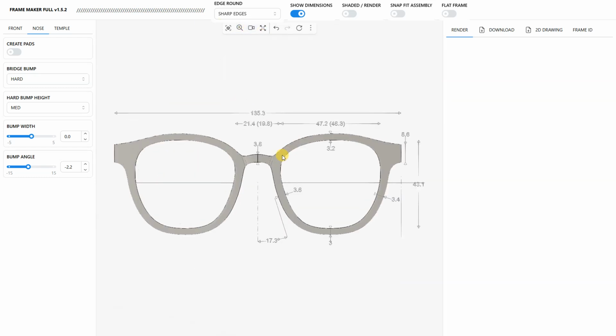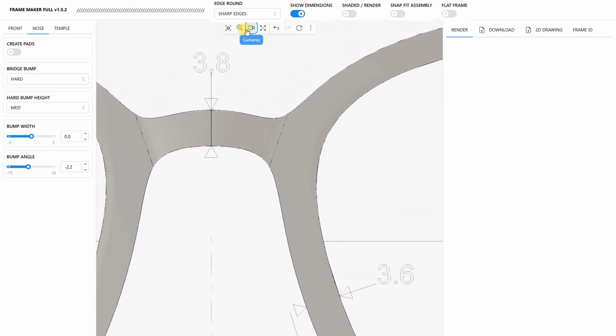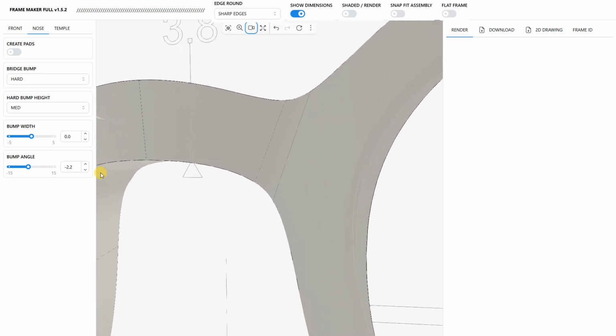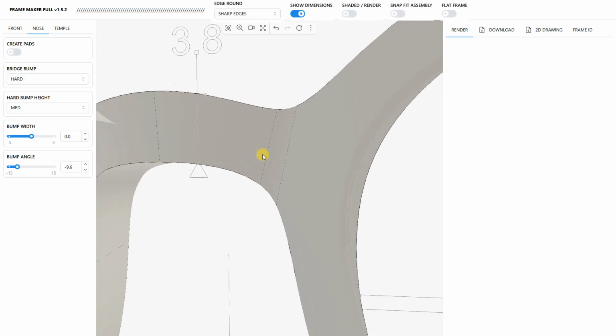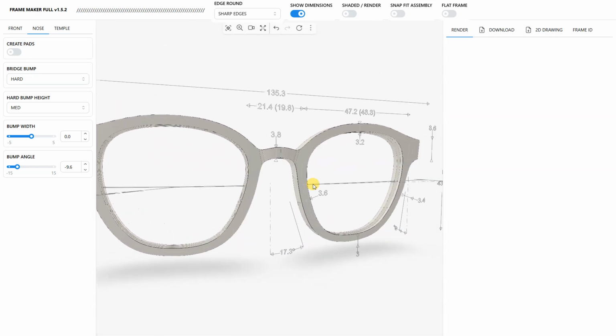But let's go to the front to see if this can help. Now let's keep that perspective. My video is going really long, but it's not a problem. Let's go even more. This is very subtle. It's not that important. There it is. But depending on your design, it may or may not be more important.